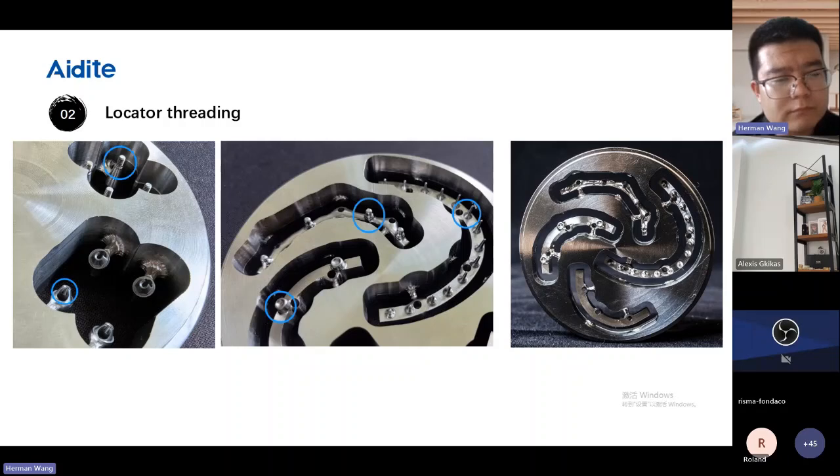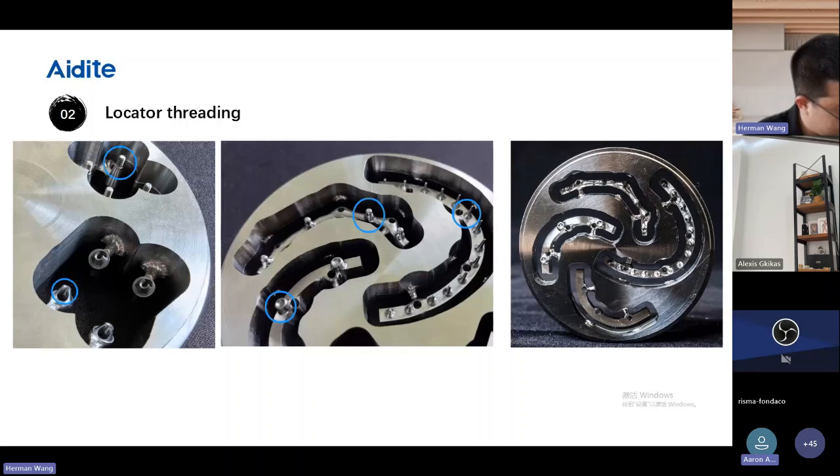So how long does it take, for milling of an implant, like a full arch implant, All-on-X zirconia with titanium bar? Say for example, we first mill the titanium and then we mill the zirconium. Is it possible to shift from one to the other, and how long does it take to finish such a job? Like shifting the mode from wet to dry, first to mill titanium metal and then to mill zirconium. Is it feasible? Is it really okay to do so with this machine?